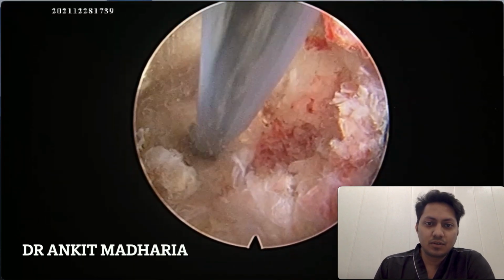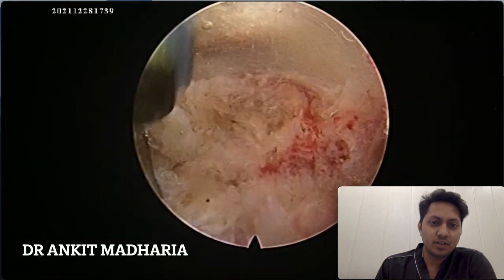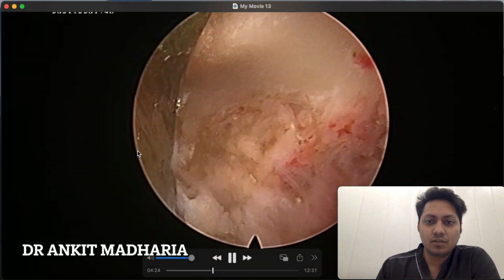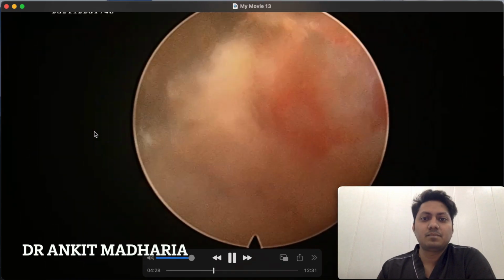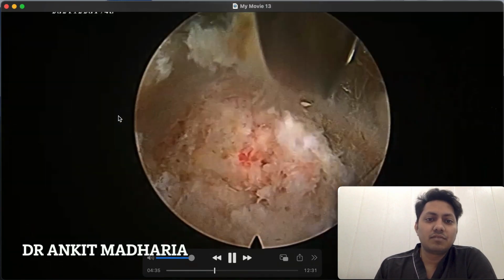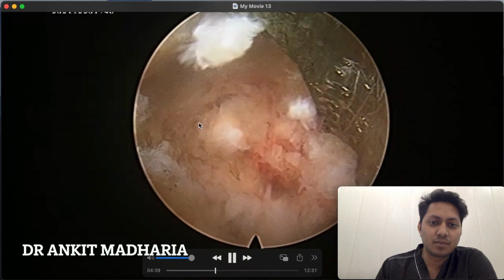Always use a good cautery to achieve your hemostasis. If there's bleeding, you need to increase your pressure. Whenever we are working in this lower part of the foramen, there will always be bleeding, so we need to be prepared for that. I'm just readjusting my cannula, and this is the part of facet joint, and this is the foramen here, the left foramen.